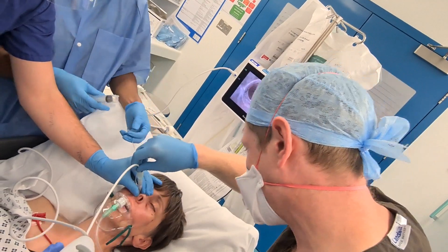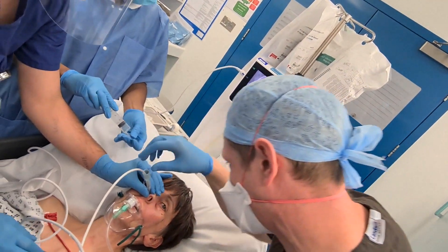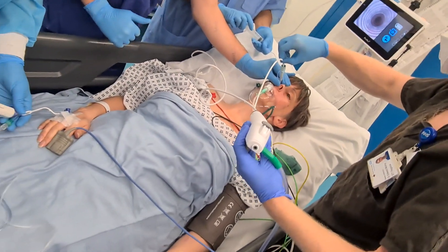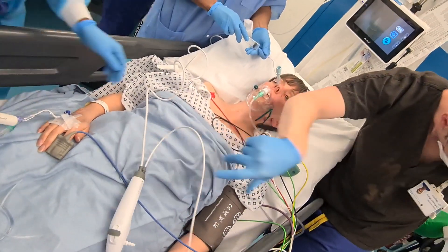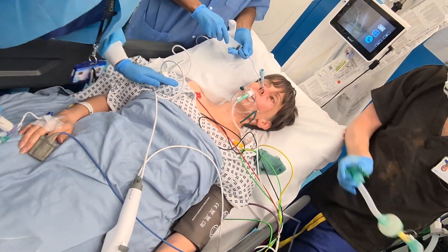Well done. Good job, Philippa. Very good. Did you see that? Thumbs up. Very good. Well done. You're going to start drifting off to sleep now. You're doing really well. Very good. Well done.